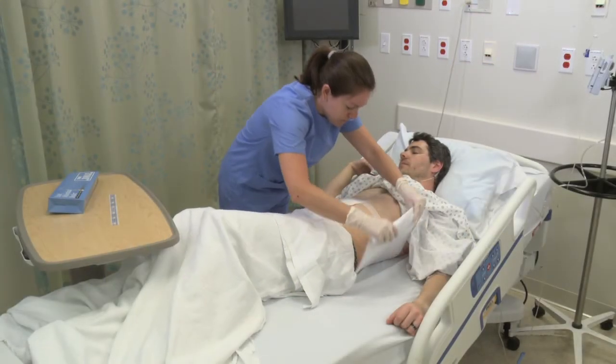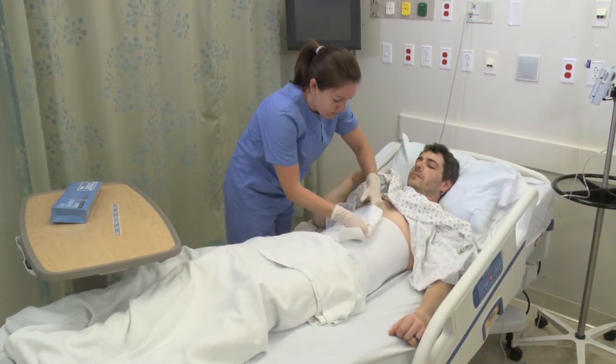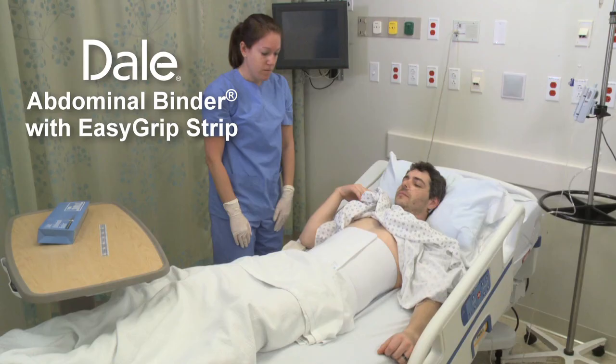With so many applications and so many benefits, both medical and economical, Dale Abdominal Binders are the obvious choice for hospitals and healthcare providers. All Dale products are made without the use of natural rubber latex.